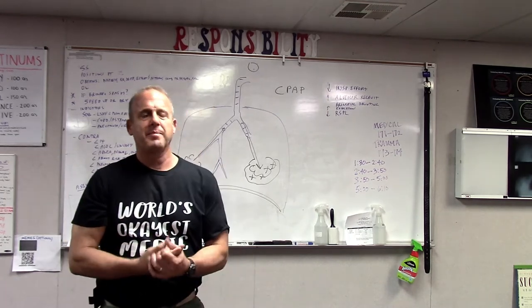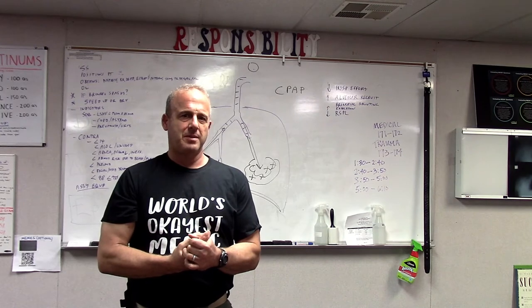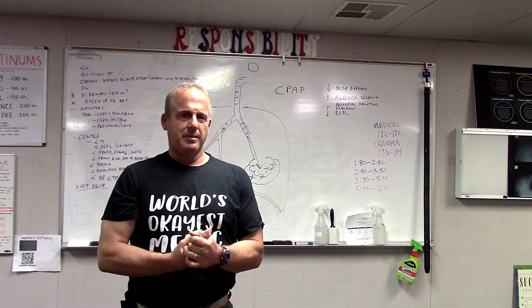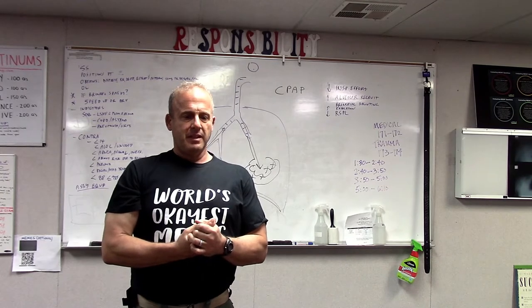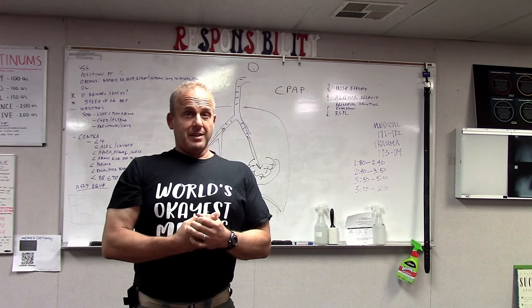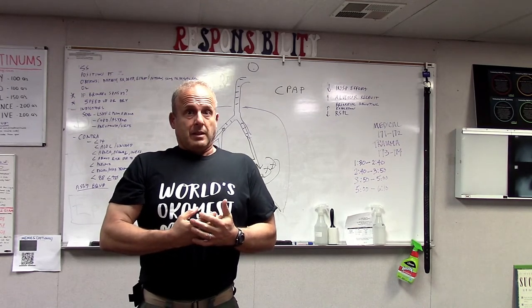Breathe along with me. Take a breath, but don't exhale. Take another breath, don't exhale. Keep going. In, no exhale. In, no exhale. In, no exhale.